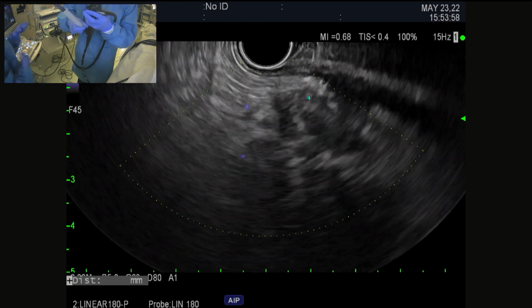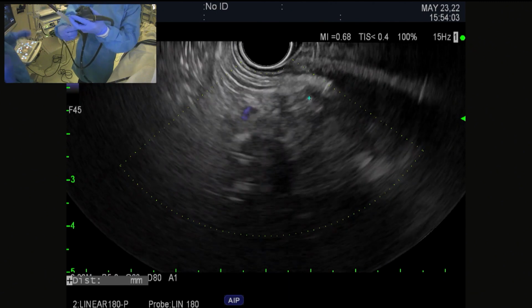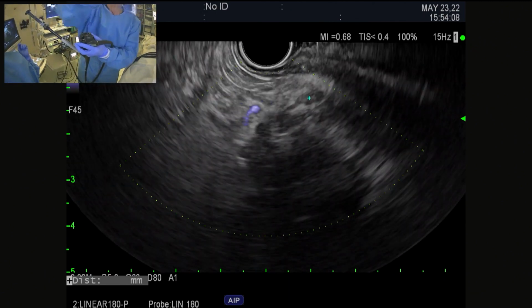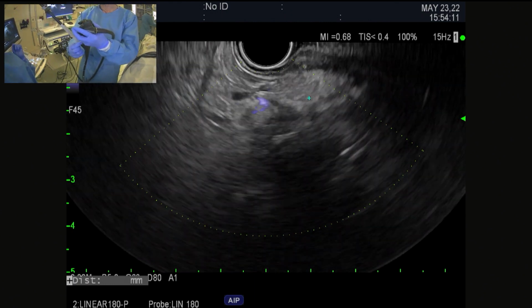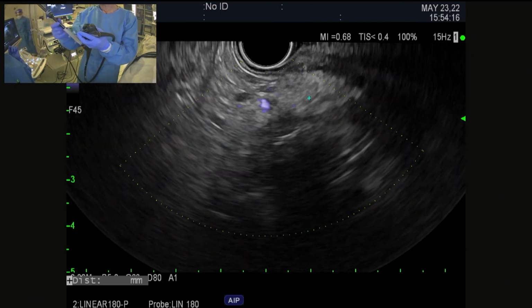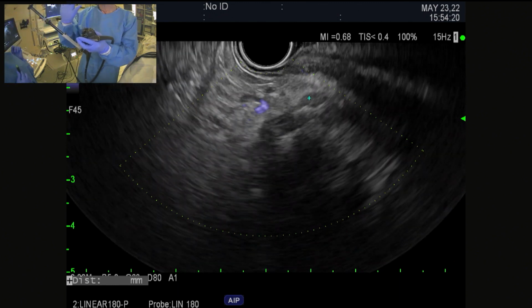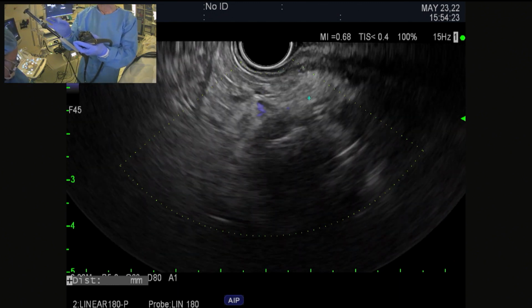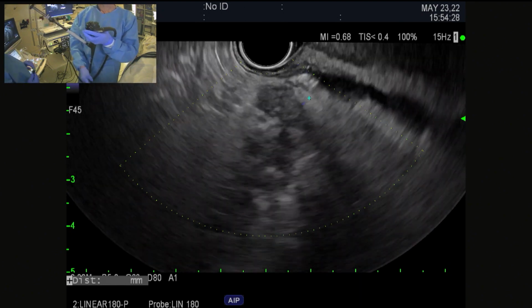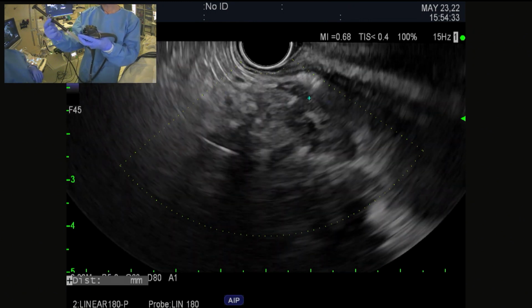So I'm just going to try to pass on a few tips here. I am going to luer lock this to the channel. You can see that. Hopefully, let's bring the camera so you can see it. All right, so we're luer locked now to the biopsy port. Now, the first step is to advance the sheath out. By the way, my nurse has not connected the cautery up yet, so we're not going to do that until I am ready to step on the pedal to puncture the collection. So my first step is going to be to advance this black hub here.